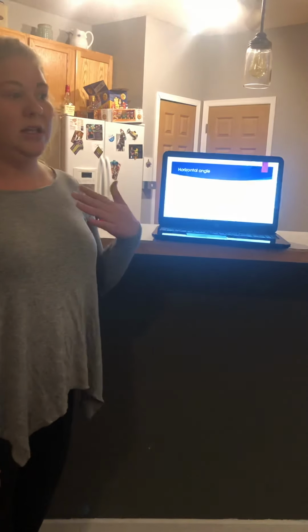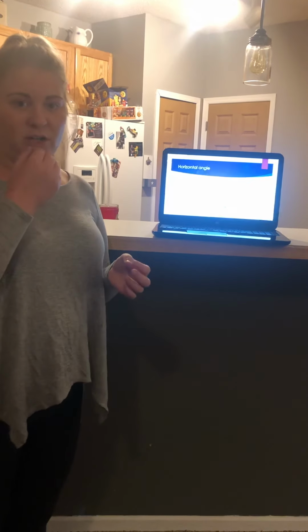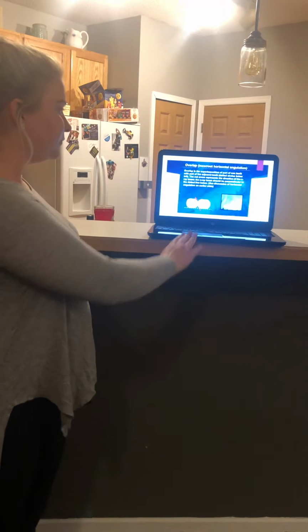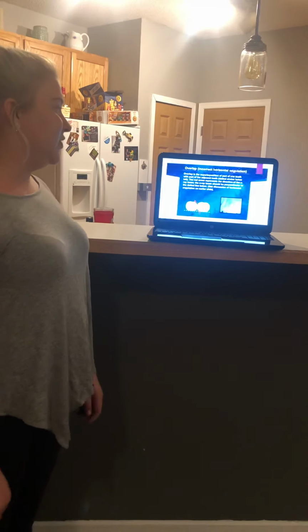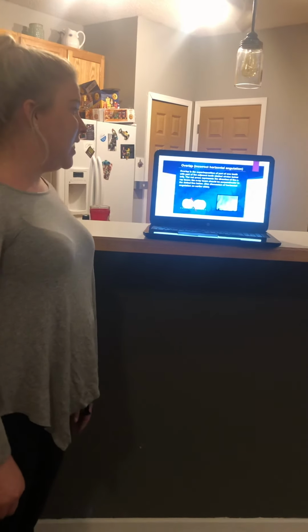For me, the easiest way to achieve this is having them almost smile while they put the sensor in their mouth to see where their teeth are, and then kind of aligning it up with the teeth to shoot between the contacts. So if this is not achieved, the horizontal angle, you will also have what we call overlap as the error. Overlap is the superimposition of part of one tooth with part of the adjacent tooth.